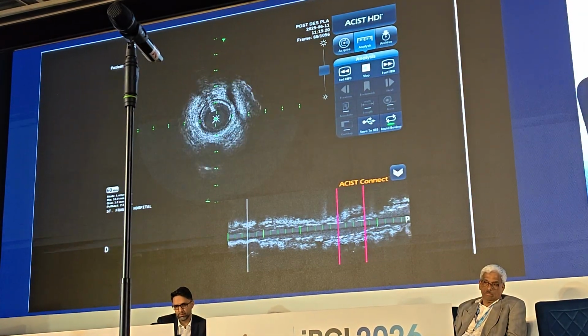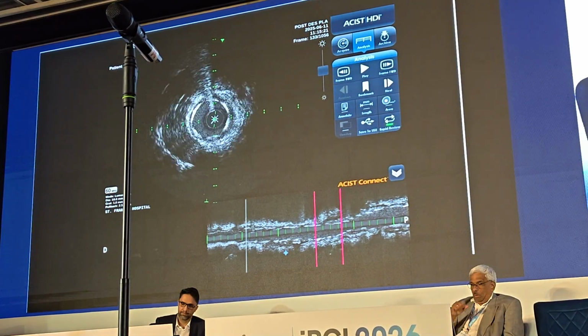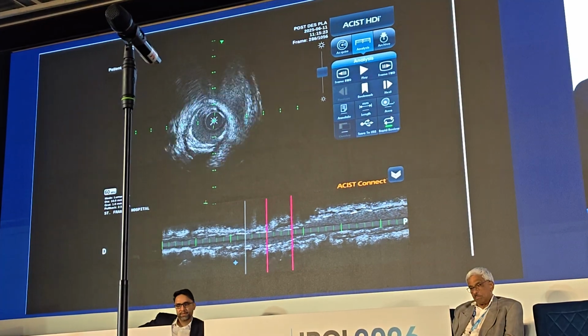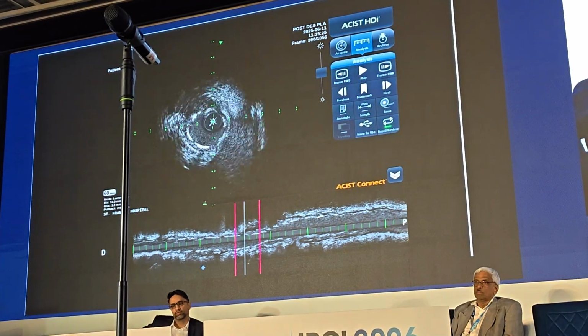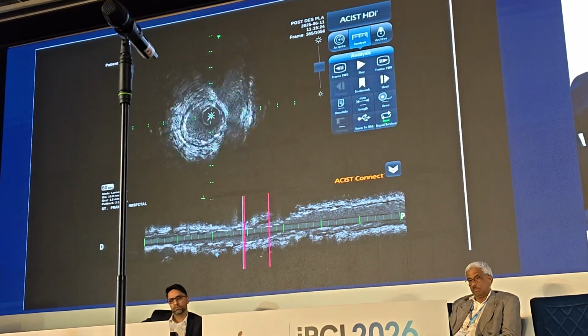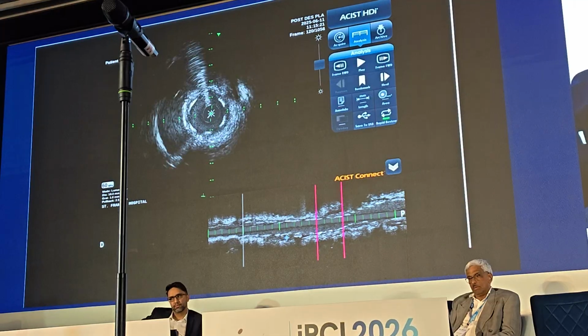Do you want to walk through the steps of MAX? Yep, so any intravascular imaging run, we have a pre-procedure MLD, as you saw, for morphology, length, and diameter. Here, we're looking for optimization. So it always starts with M for medial dissection. We start at the distal edge, make sure there's no edge dissection. We saw that's fine. Then we go to the proximal edge, make sure no dissection.